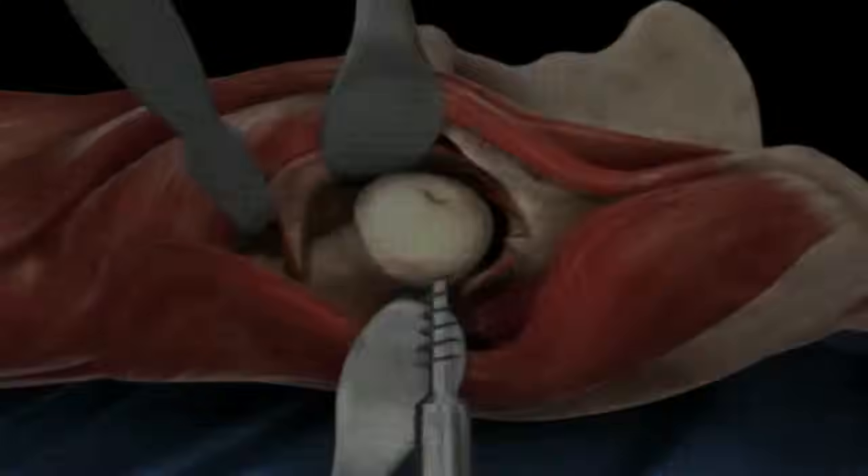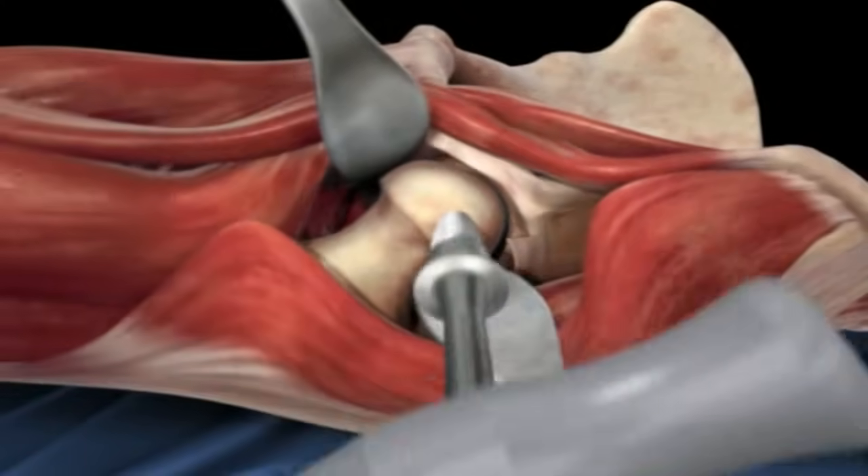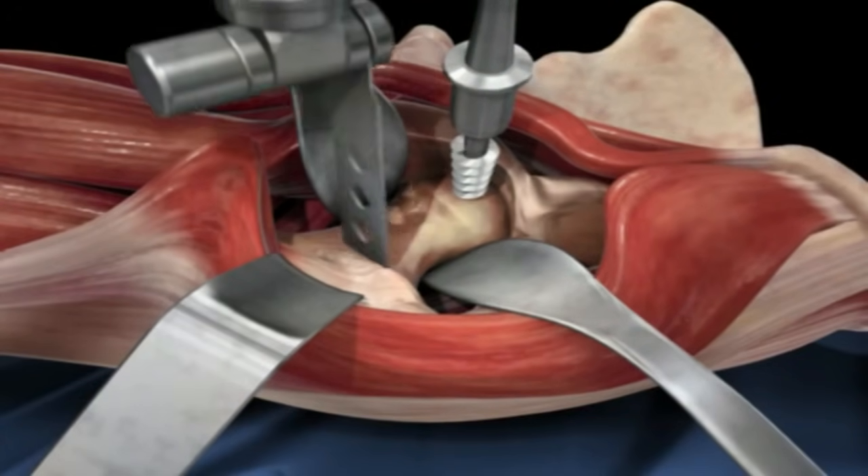The next step is to cut the femoral neck so that the head and neck portion can be removed. Here an oscillating saw cuts through the femoral neck.